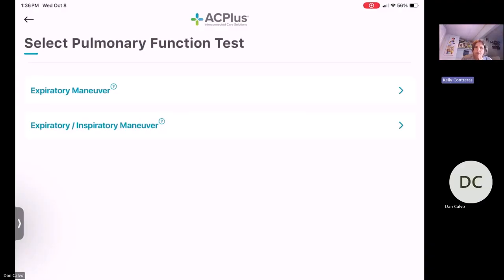As per the American Thoracic Society, the European Respiratory Society, and American Family Physician, spirometry interpretation to determine a suggested ventilatory impairment pattern does not use inspiratory measures. And there's actually a 2021 article from the ATS and ERS on spirometry interpretation: expiratory airflow is generally assessed by spirometry, with the most important indices being the FEV1, FVC, and the FEV1/FVC ratio.